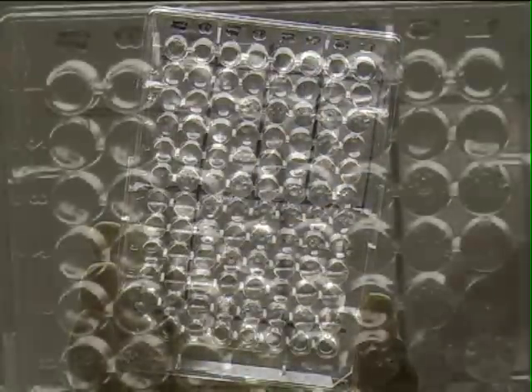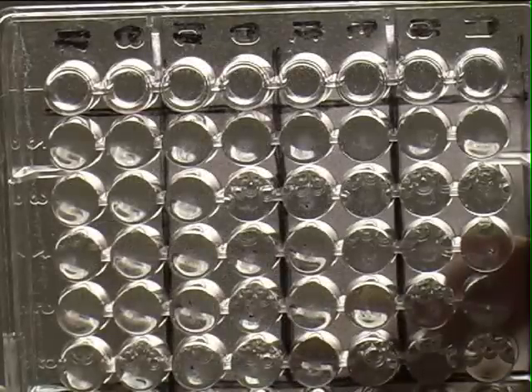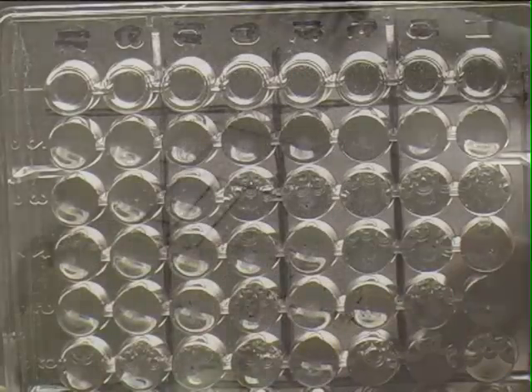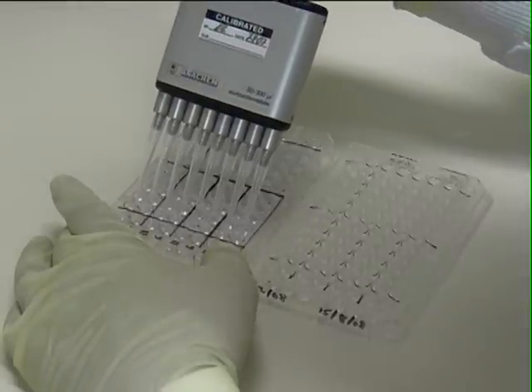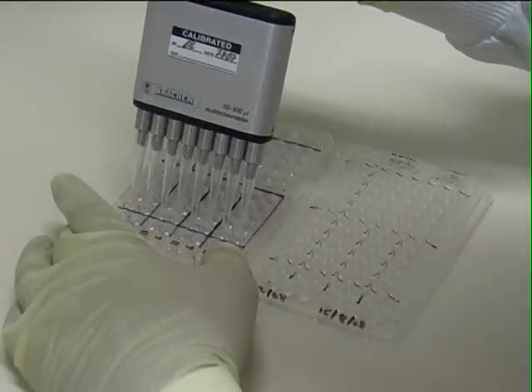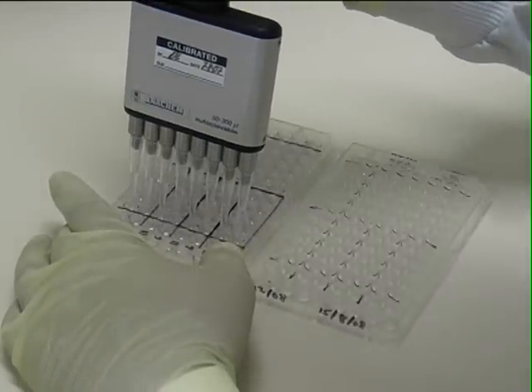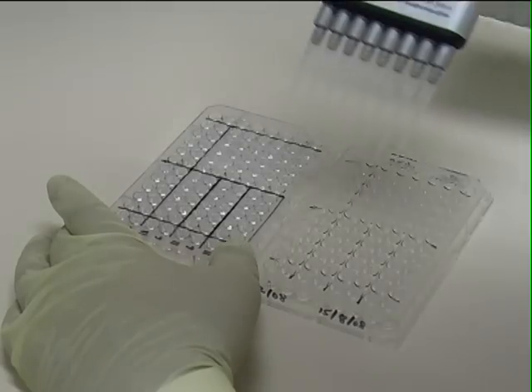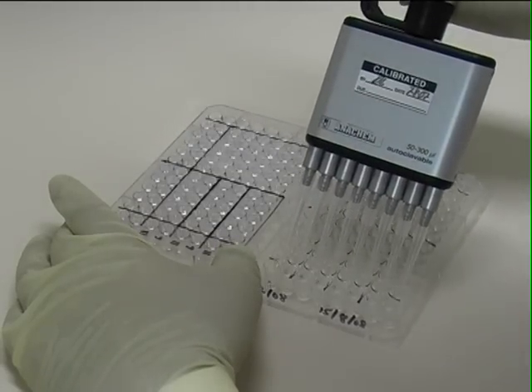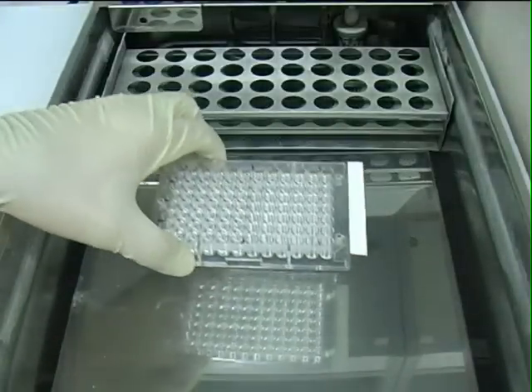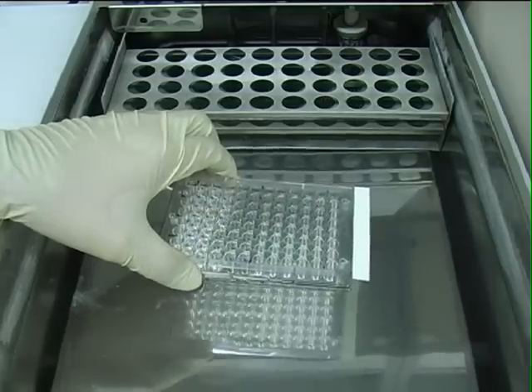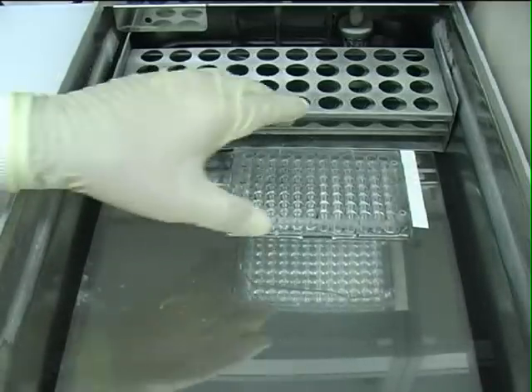When the lysate is finished spinning, you can usually see a deposit of cell stroma in a circle on the bottom of the well. We then carefully remove 100 microliters of the supernatant from this plate and add it to the corresponding wells in the flat well plate. The plate is then sealed and incubated for half an hour at 37 degrees centigrade.